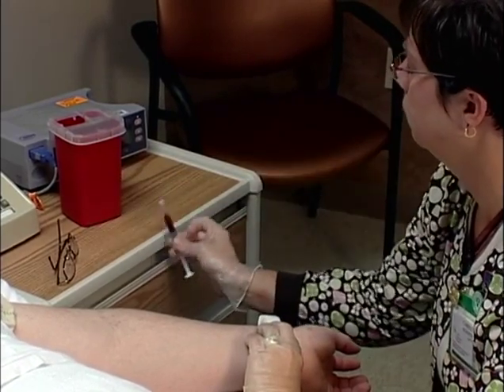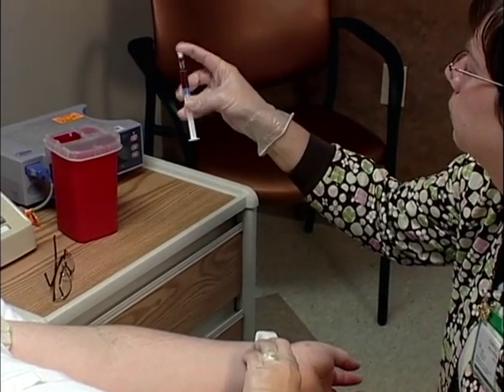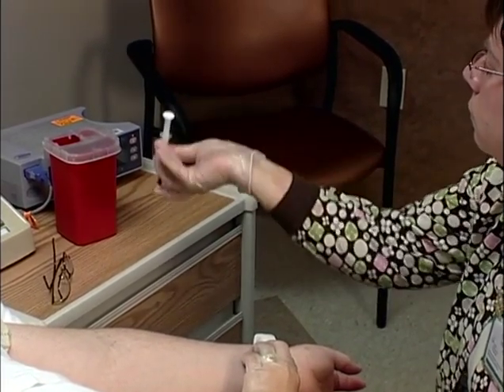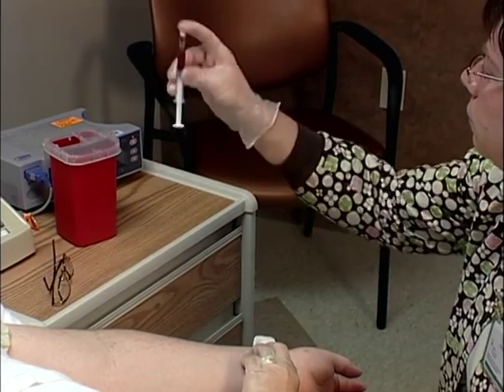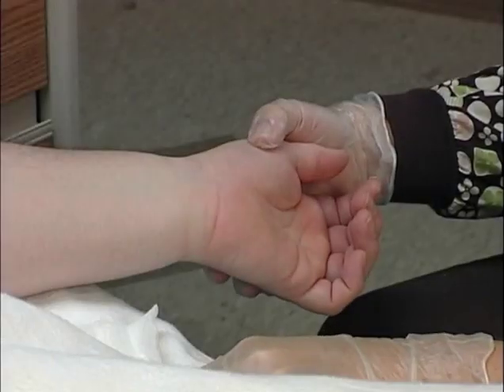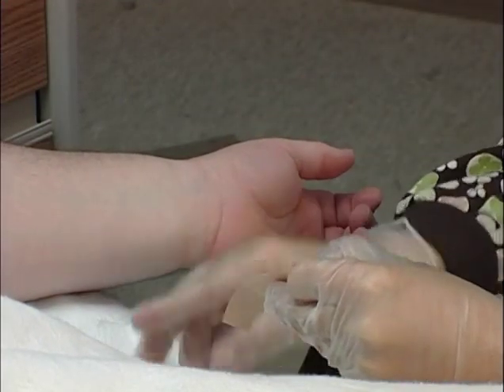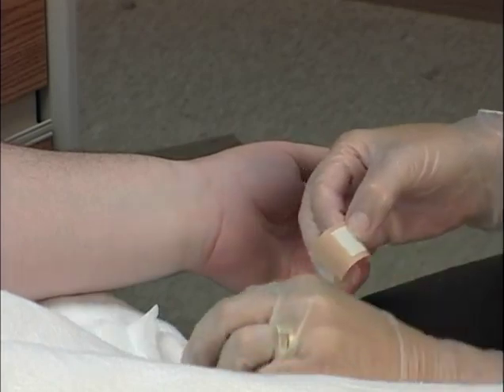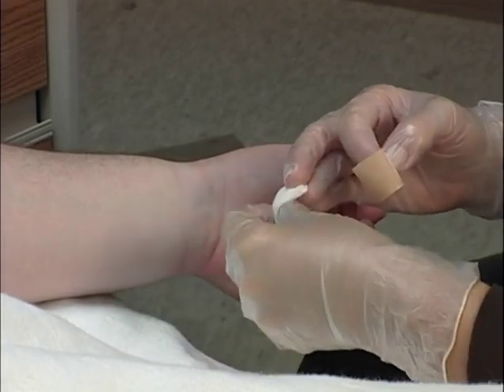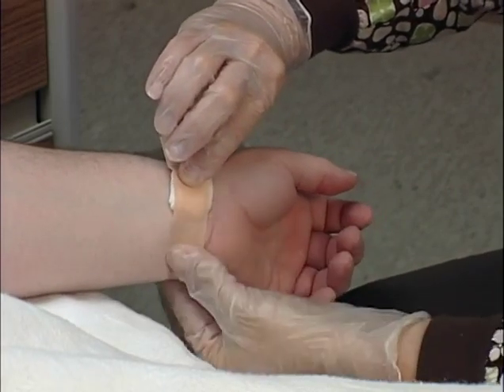Cap the syringe, evacuate any air bubbles, and invert it according to manufacturer's instructions to assure adequate mixing of the specimen and anticoagulant. Carefully observe the puncture site for bleeding and hematoma formation. Once assured that bleeding has stopped, apply a pressure bandage. Be alert to signs of poor circulation in the extremity.